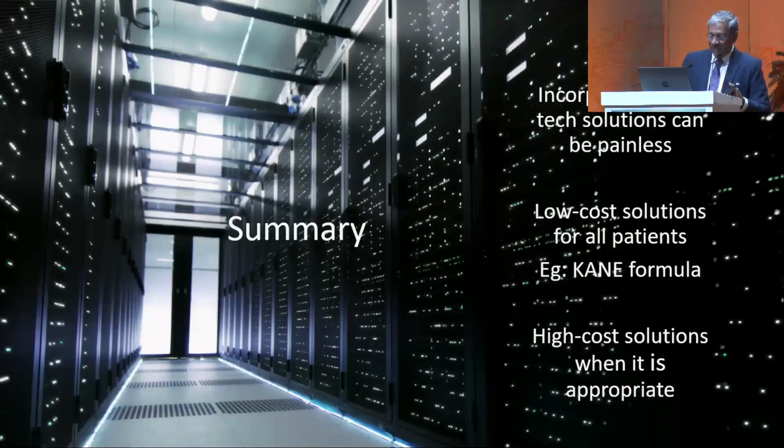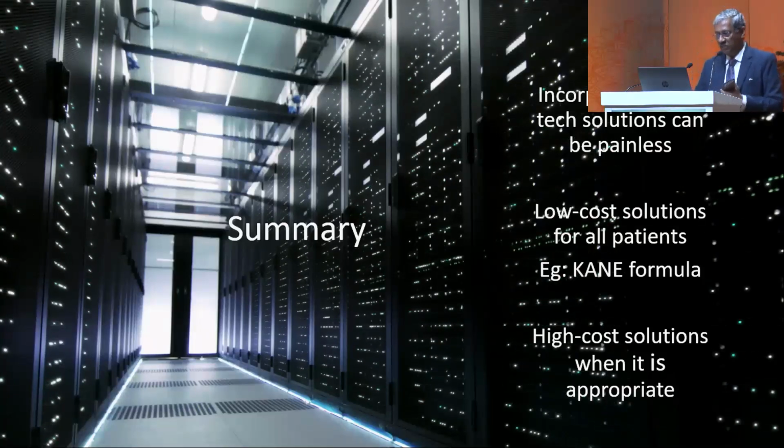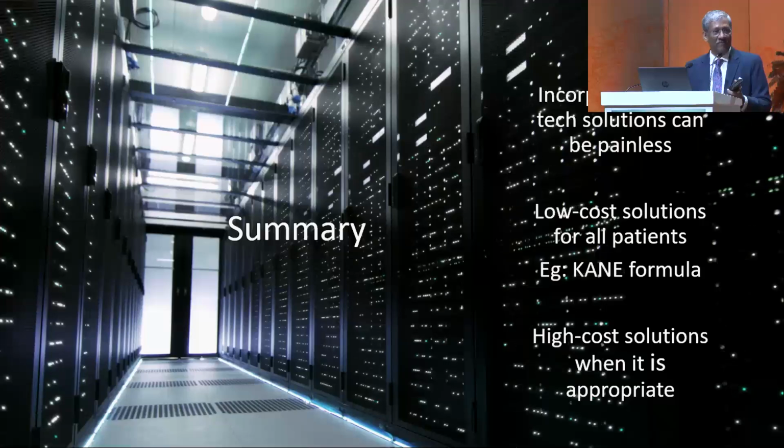So incorporating high-tech solutions can be painless if you choose low-cost solutions like using an online Barrett's or Kane formula, which is applicable to all. The high-cost solutions should be used only when they are appropriate.